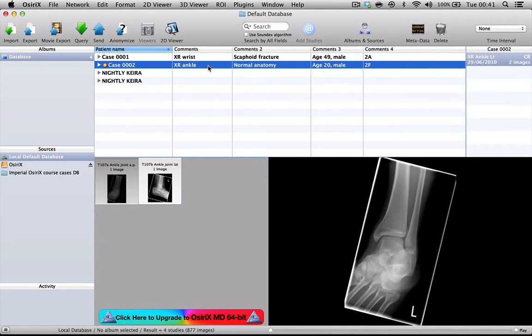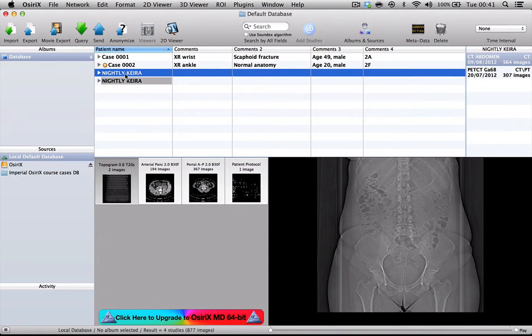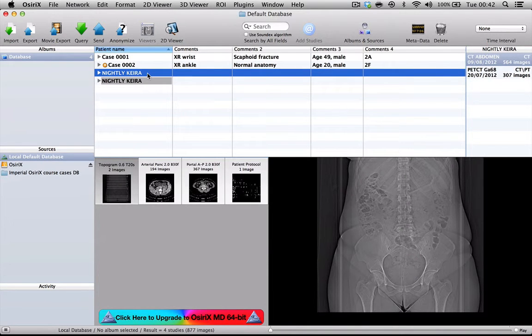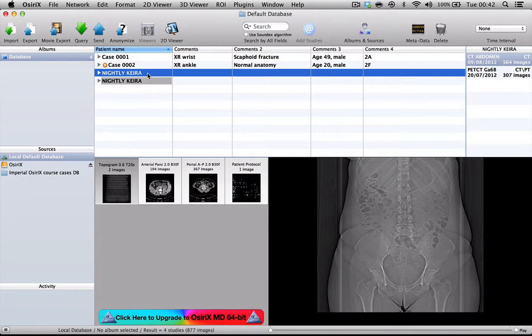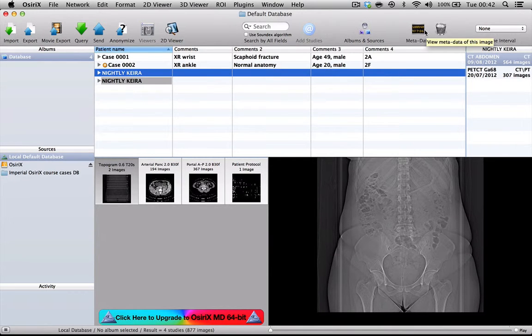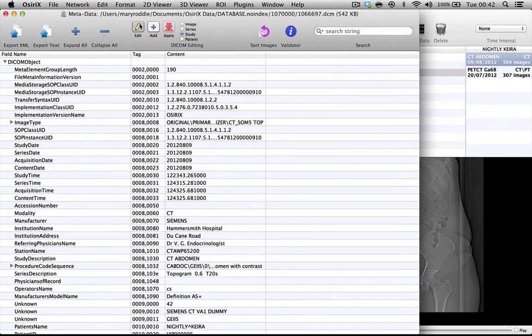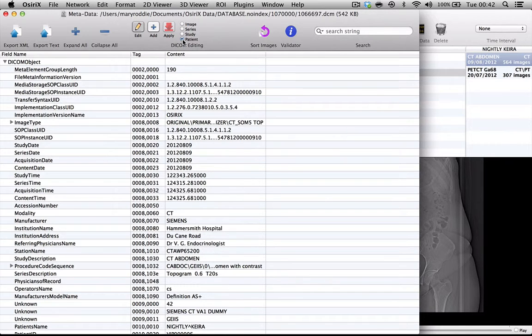The final case, as you can see here, has got both the CT of the abdomen and a nuclear medicine scan, so quite a big number of images. This would be quite a good case to anonymize using metadata. I'm going to select metadata and I'm going to activate the editing tool. But this time, rather than keep it on study, I'm going to ask for the whole patient to be anonymized.